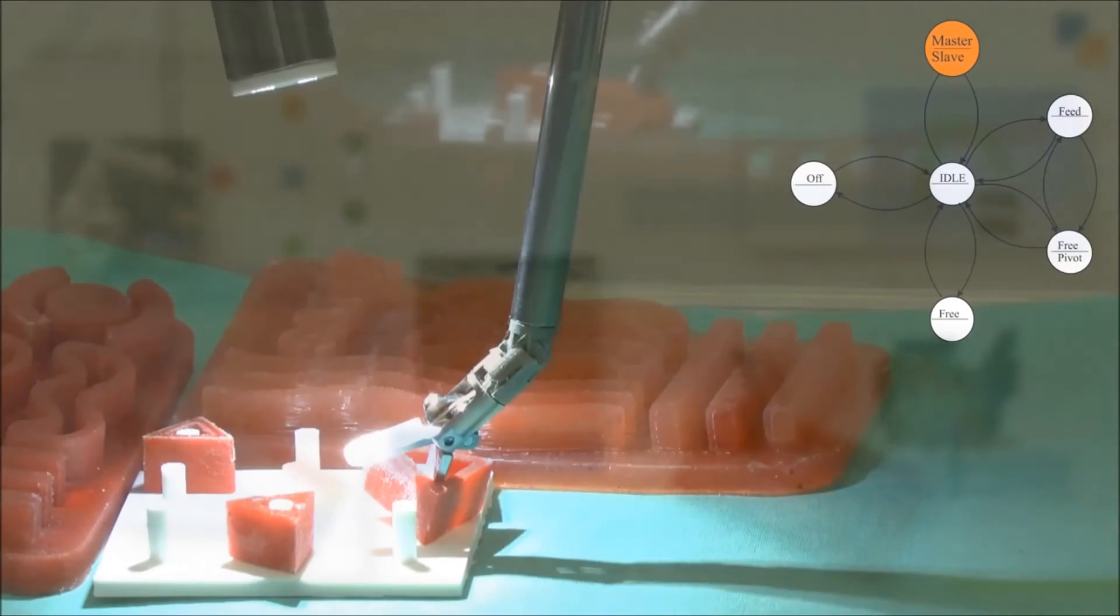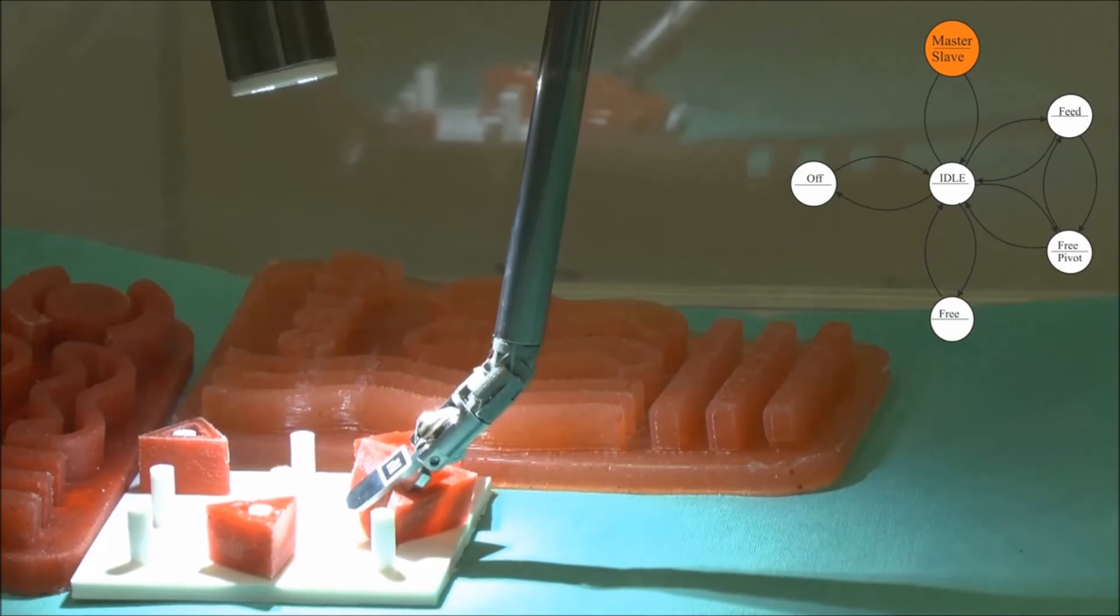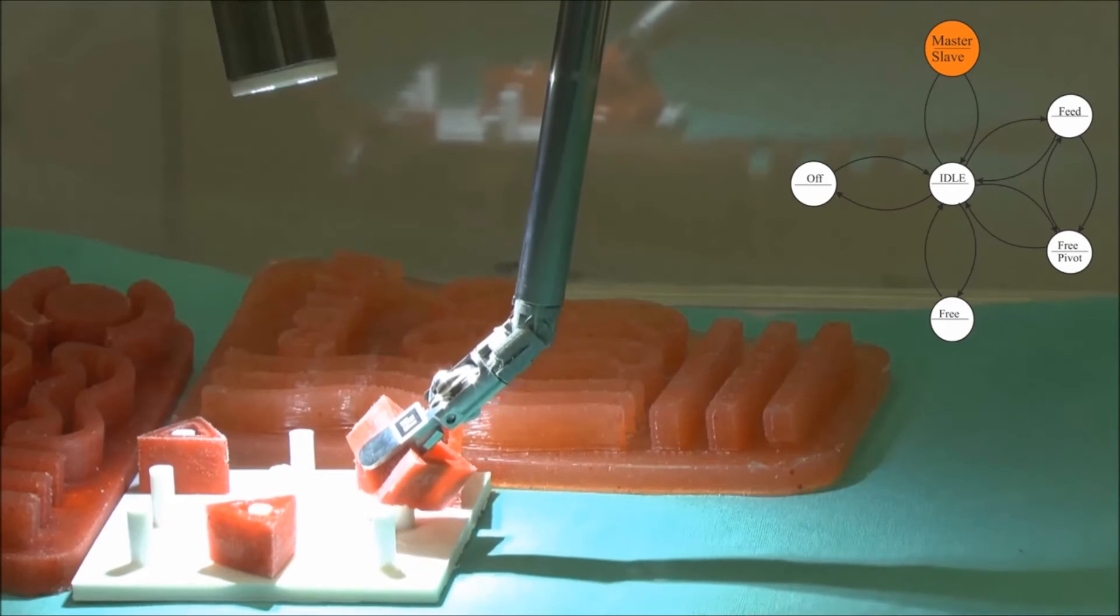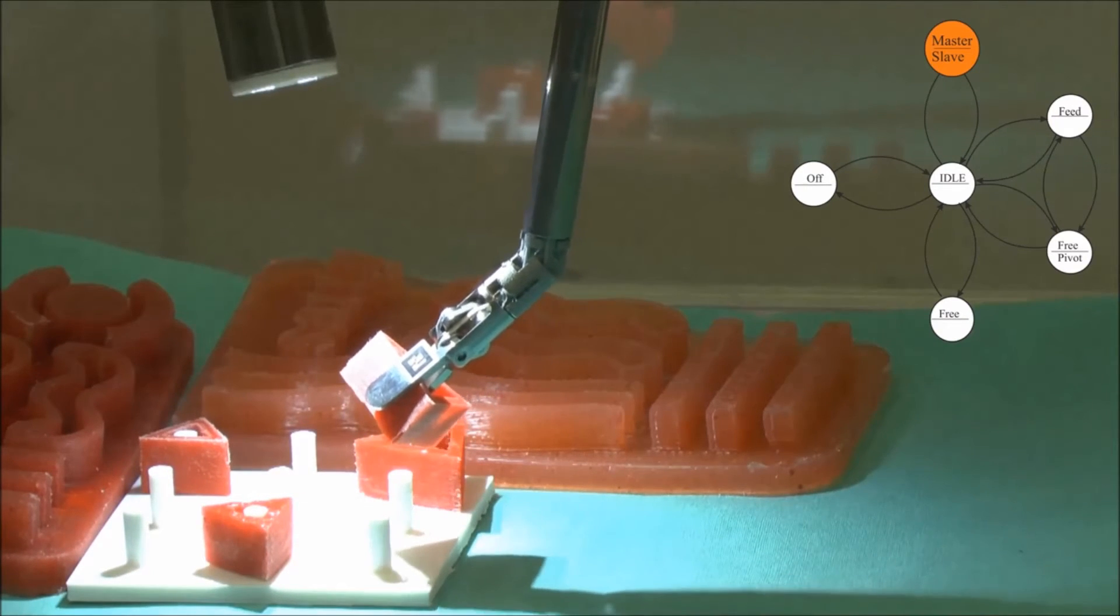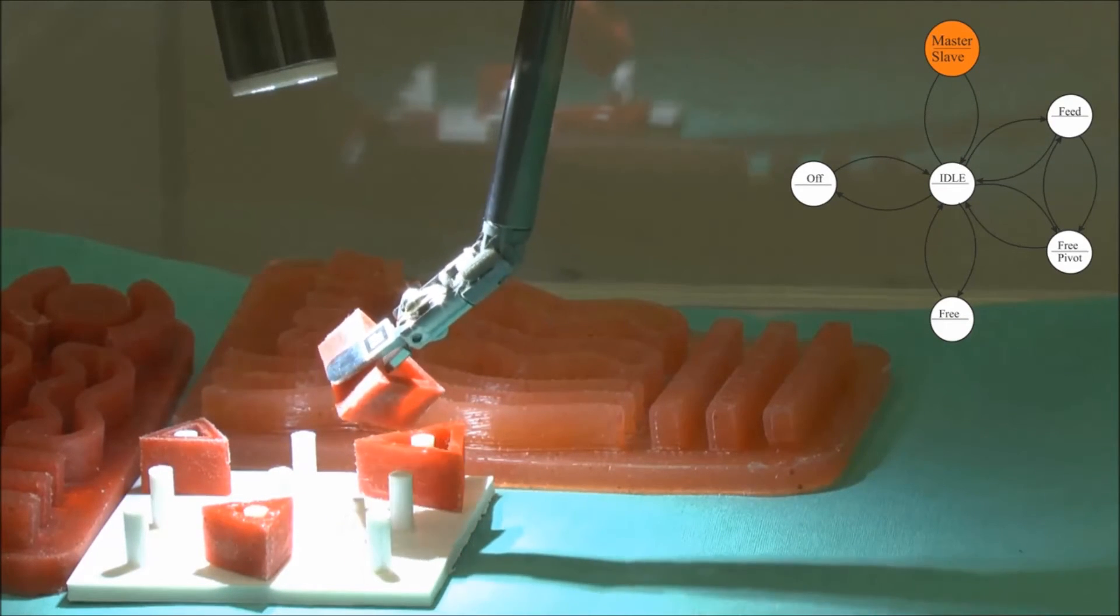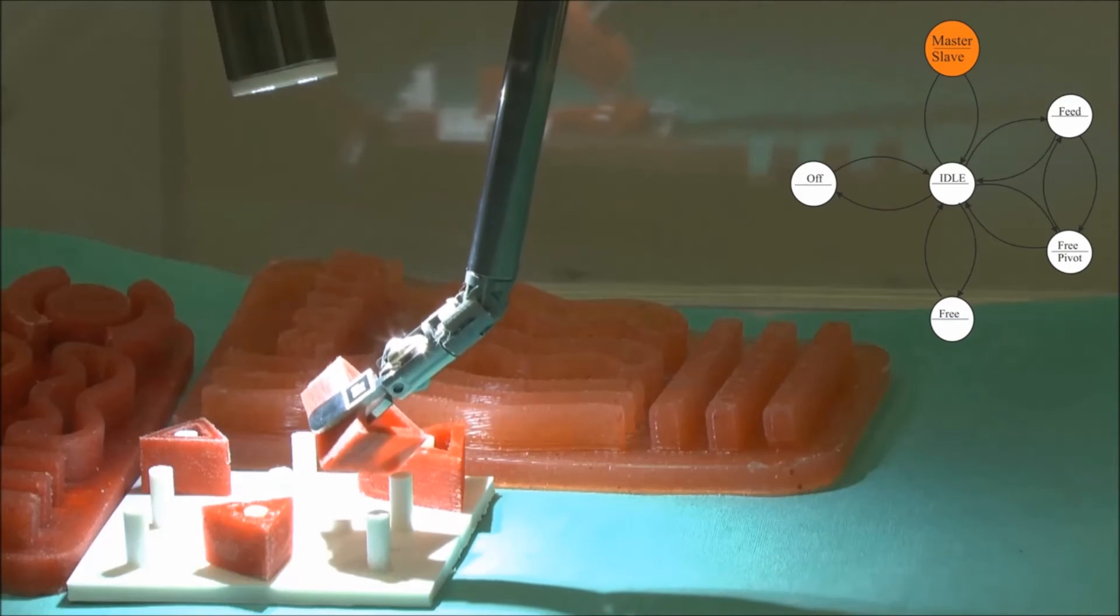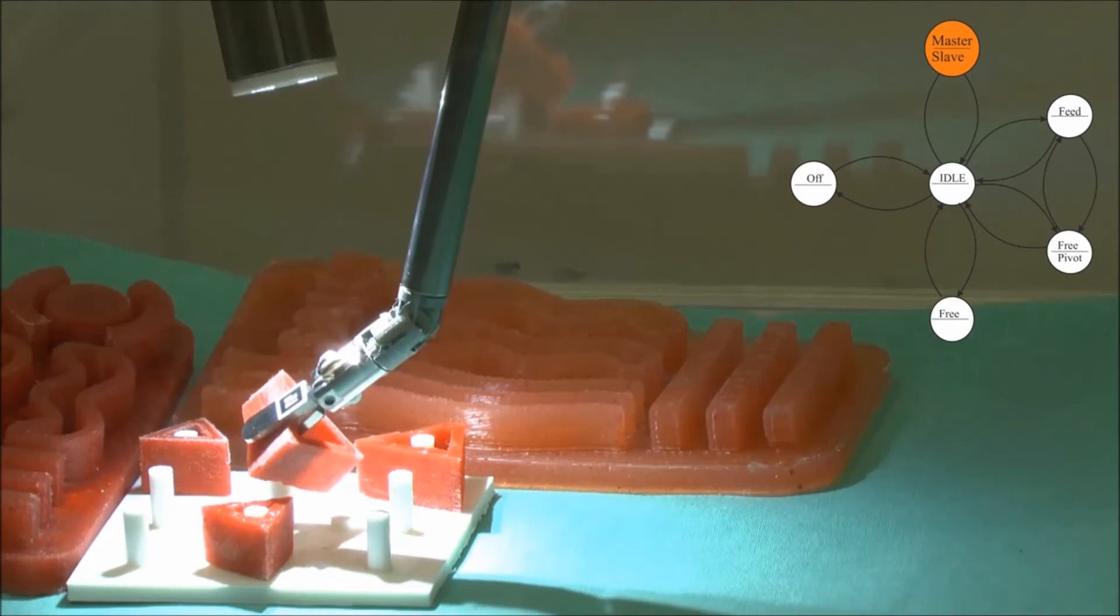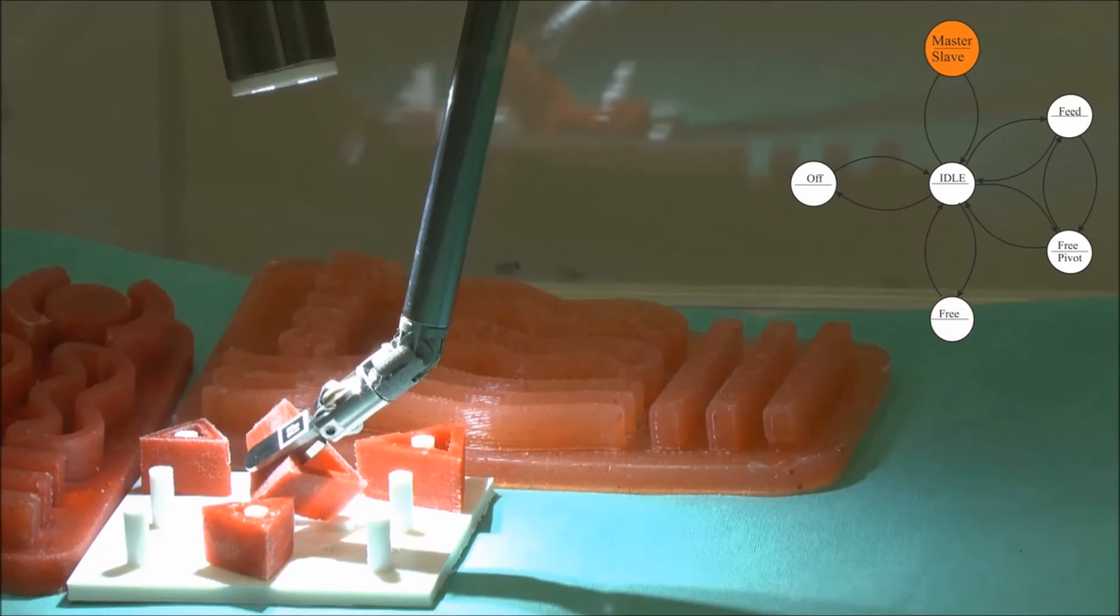Our testbed is used to demonstrate a manipulation task. The master-slave control mode is used to telemanipulate the instrument tip with a Space Navigator as input device. At the top, our custom-made stereo endoscope is visible, providing illumination and capturing the operation field.